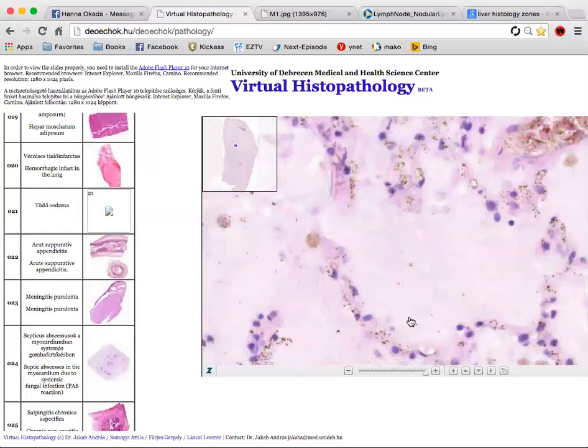In the physiological situation, we cannot really see the color inside the alveoli, but in this slide we can see it lighter, very light. If you were in an autopsy room and cut into the lung and pressed it a little with a knife, you would see this froth coming out, this kind of foam. You're going to see that the lungs are full of fluid.